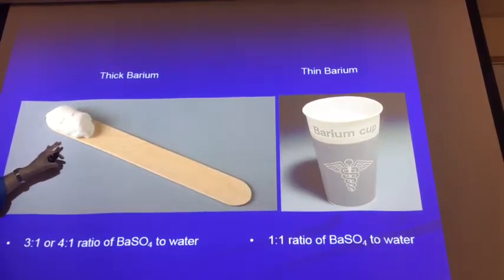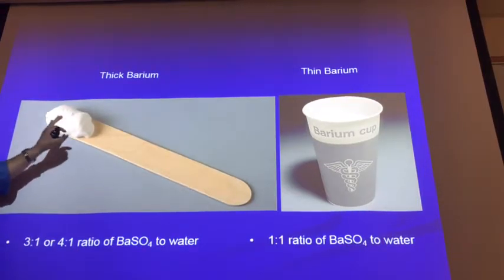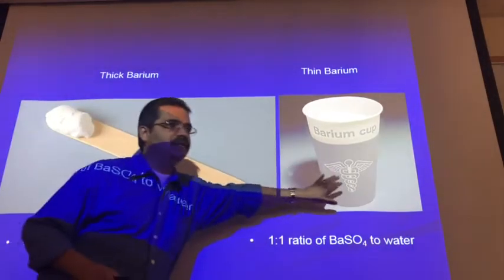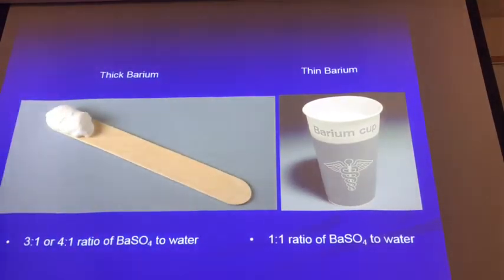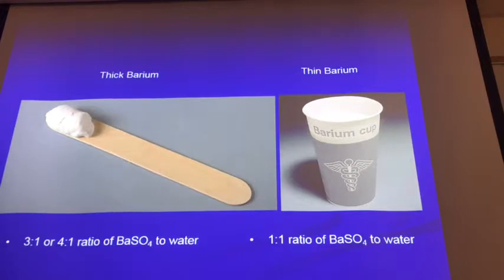Okay. Can you repeat that one? Yes, I'll repeat it again. Okay. Typically, when you use thick barium, you will mix it with air. You might use a little bit of this, and then you use air, so you can have something called the double contrast image. Why double contrast? Why is it called like that? Because you have air. Air is your negative contrast media.